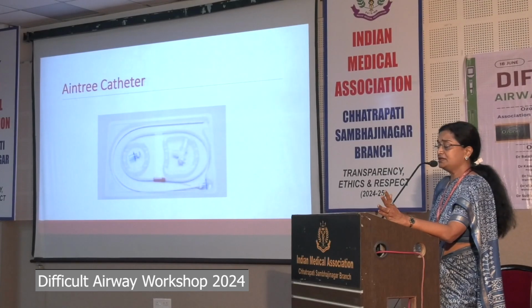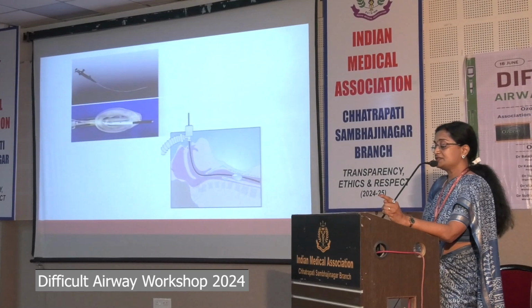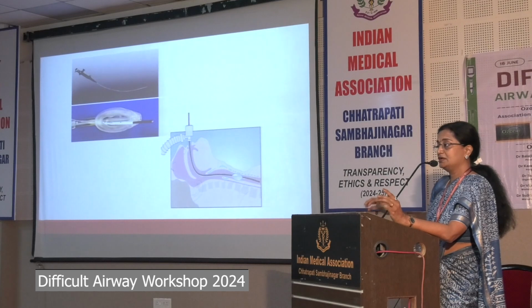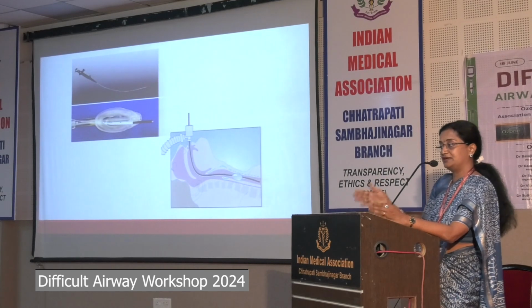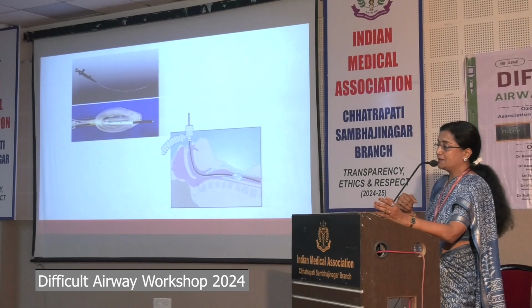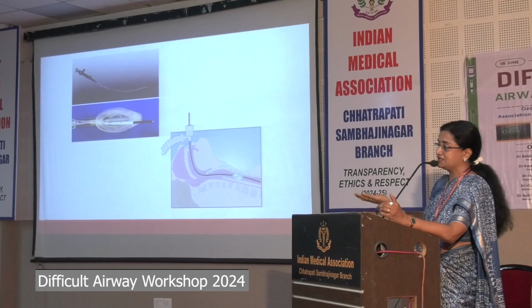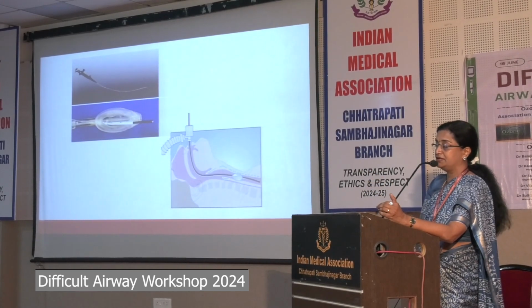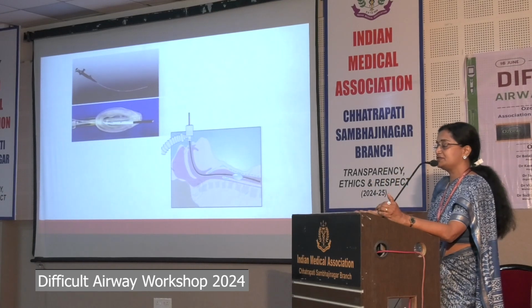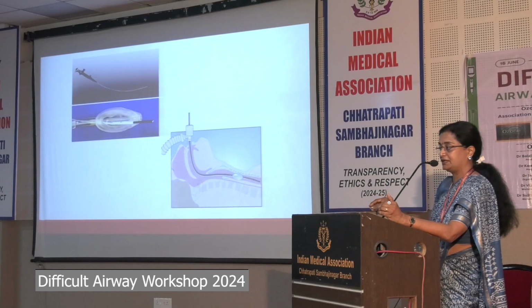Aintree catheter. Aintree was also a game changer, where the Aintree catheter was used initially at a hospital in Liverpool. Now the hospital is called Aintree Hospital. They have named the hospital itself as Aintree. Now, once you pass the SGD in your plan B, when you're selecting an SGD, you have to see whether this case you're continuing as a surgery or it is a stopgap. You can take an SGD in such a way that you can intubate through it. So preferably you have to take an intubating LMA.